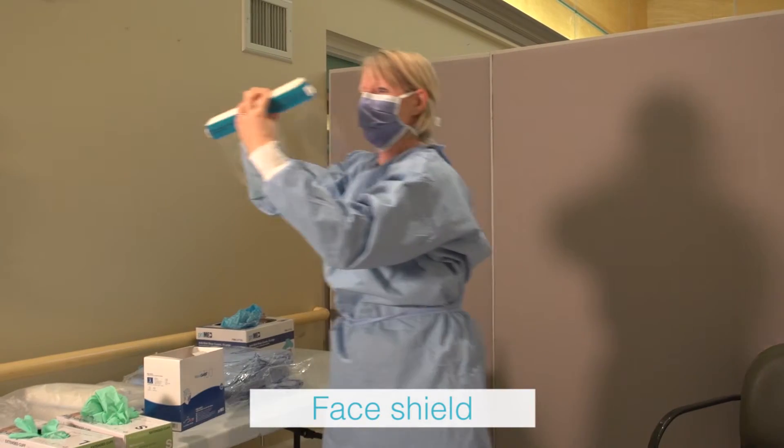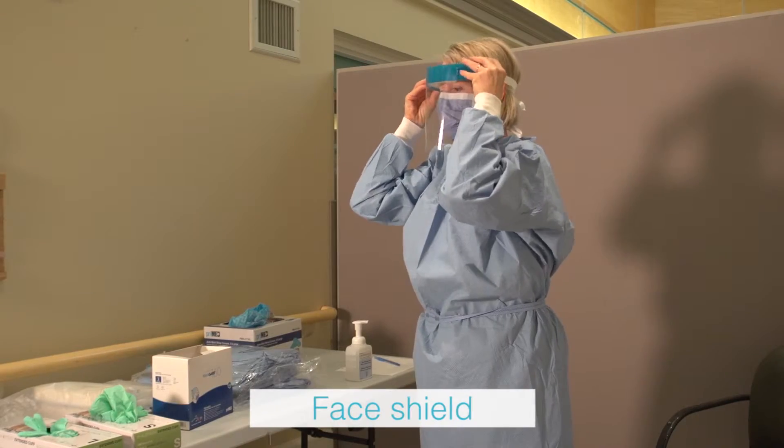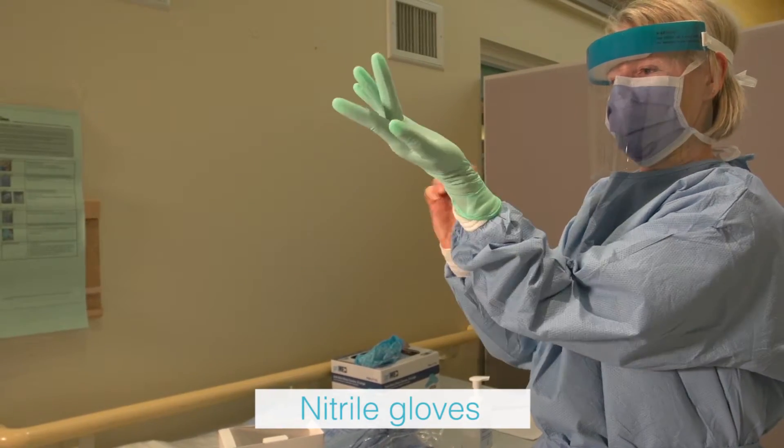Place face shield over the mask. Apply extended length nitrile gloves and pull gloves over the cuffs of the gown. Inspect for tears.